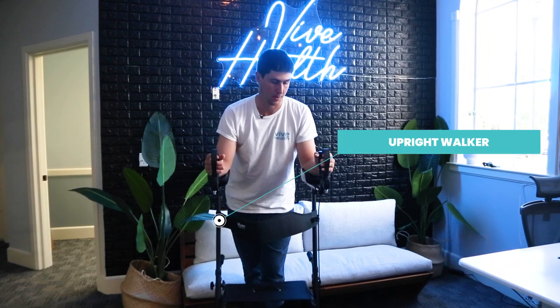Hey everybody, how's it going? Danny here with Vive Health. I have our standard upright walker, MLB1033. I'm just going to show you guys how to stand and sit.